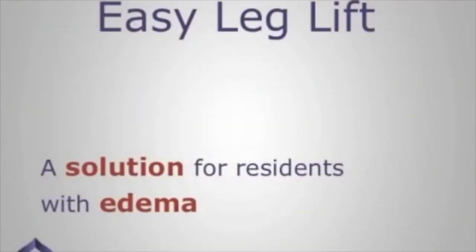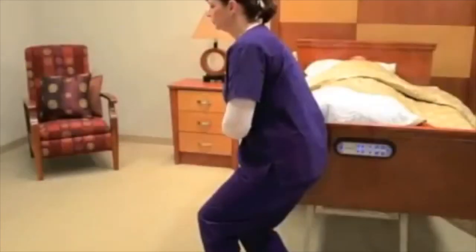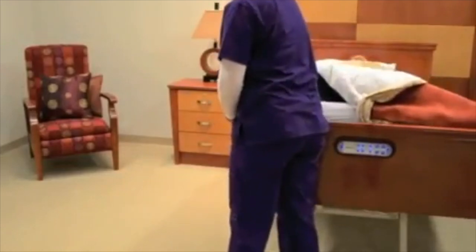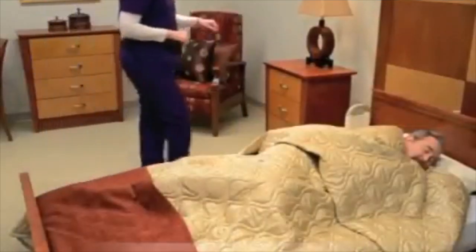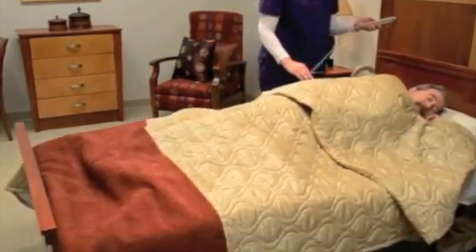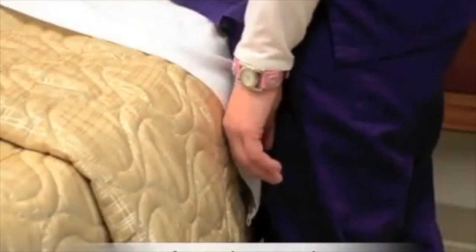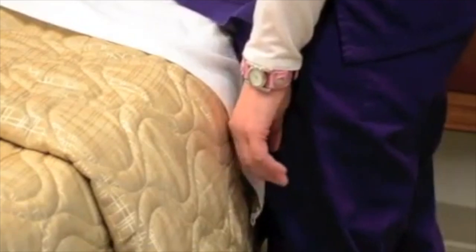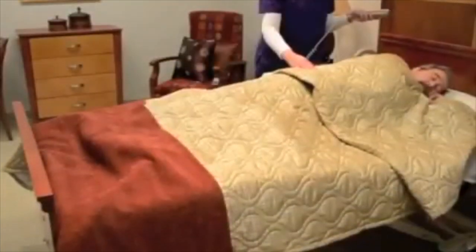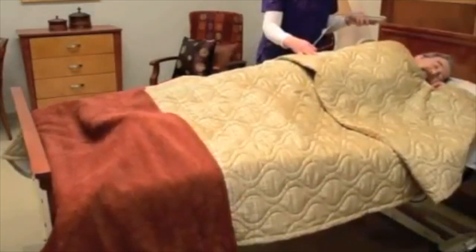Located at the foot section of the bed frame is a feature known as Easy Leg Lift. This feature is built into the bed frame and is an ideal solution for providing care to residents with edema of the lower extremities. To do this, first, put the bed in a flat position. Then, raise or lower the bed to a safe working height. A good rule of thumb to follow is to stand next to the bed and then position the bed where the surface is between your waist and knuckles.